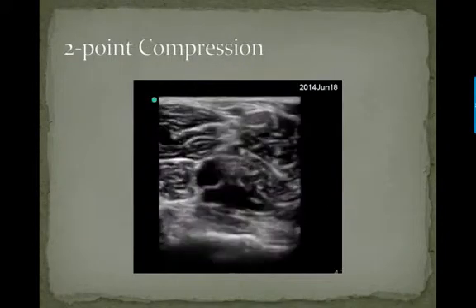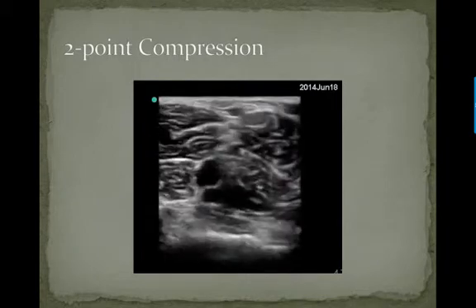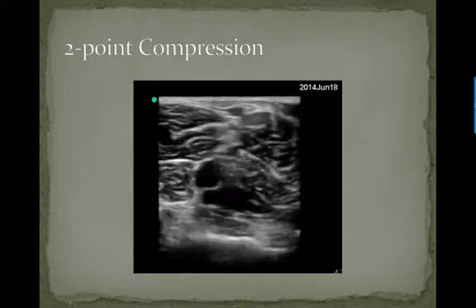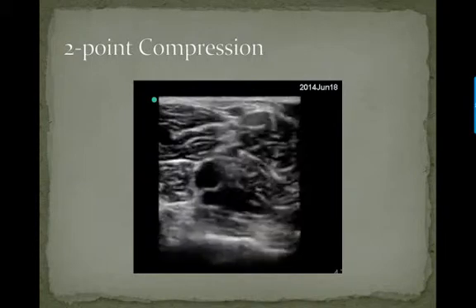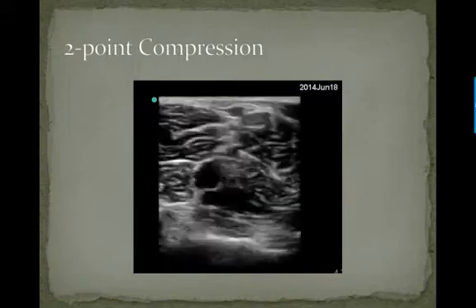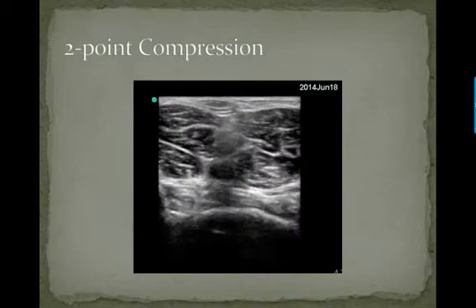Next we're going to look at the popliteal vein in the popliteal fossa. All deep veins run next to arteries, which is a clue to knowing that you're looking at the right vessel. It's easy to accidentally look at the superficial vessels and see the veins compressing, thinking that you have a negative study.